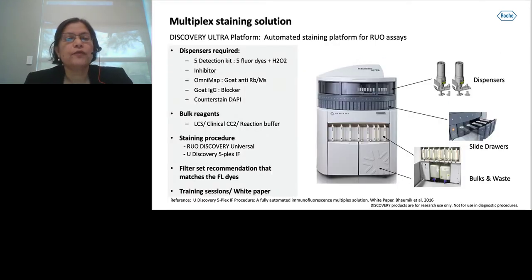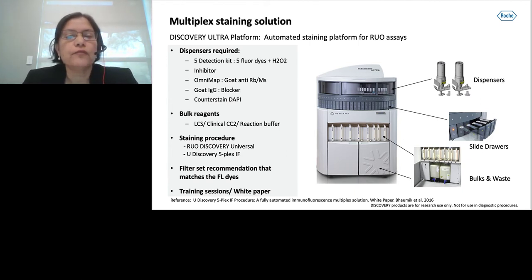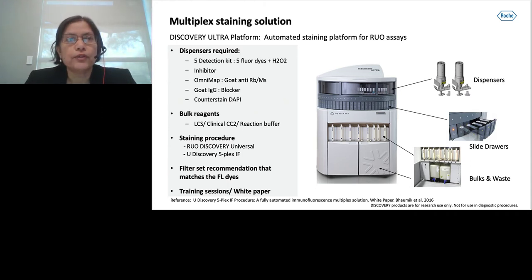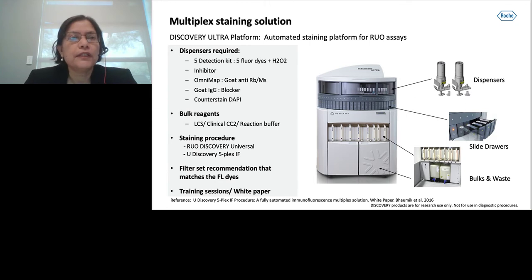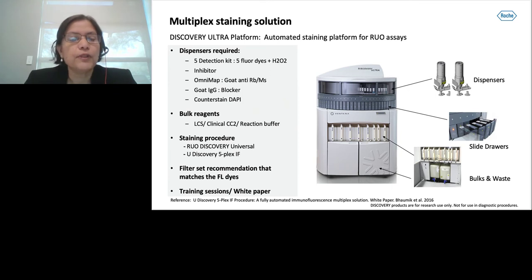For those less familiar with the Discovery Ultra instrument, this is an automated staining platform for RUO assay development. It's a high-throughput autostainer that can stain up to 30 slides. The instrument gives reproducible staining, minimizes human error, and saves time. In the top carousel there are 35 dispenser holders. In the multiplex stain, some dispensers involve detection kits, inhibitor, secondary antibody, blocker, and counterstain DAPI.